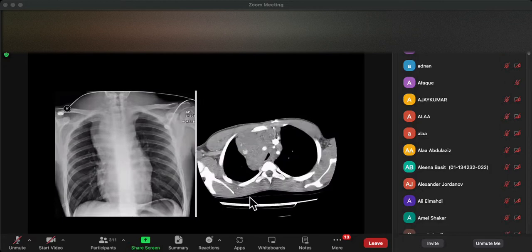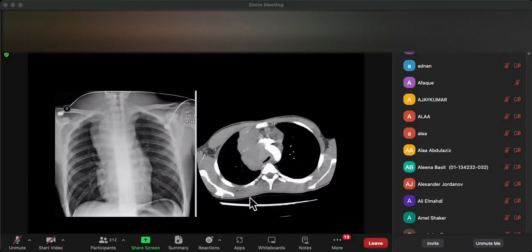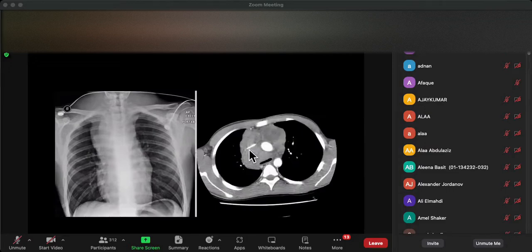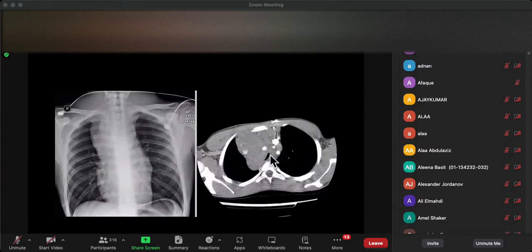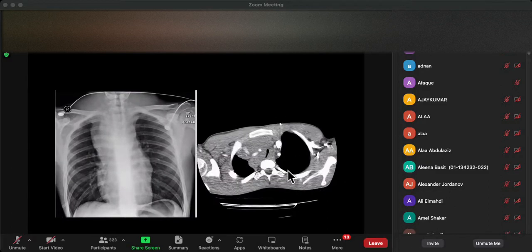And you can see that the patient has effectively got an SVC obstruction. There's the SVC, which is very slit-like. There's marked compression of the trachea. And we've got dilatation and enhancement of the chest wall vein on the left-hand side. Why is it on the left and not on the right? That's because the patient has been injected on the left-hand side.